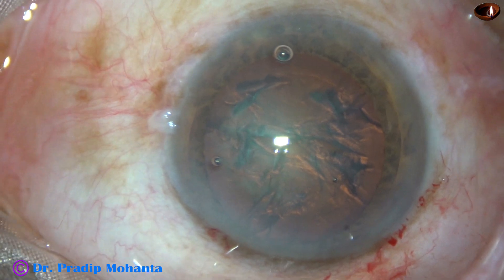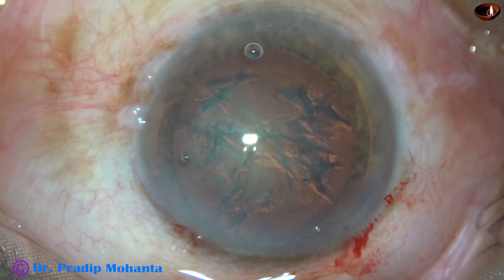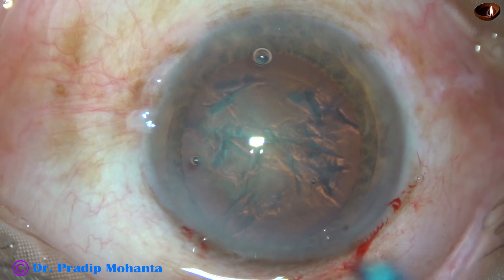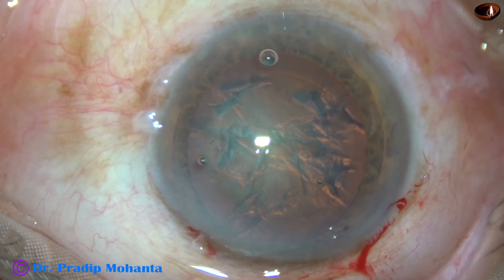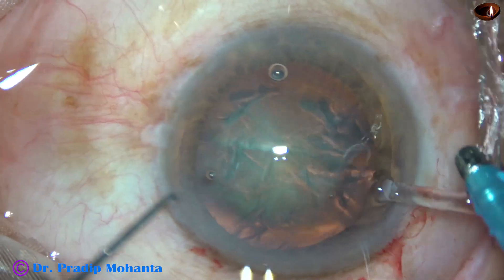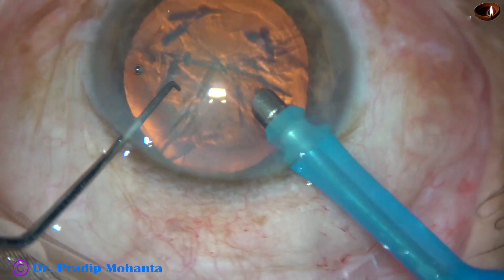The tip of the phaco needle is introduced. The machine is set at 450 mmHg vacuum and 45 flow. Ultrasonic energy is set at 60%, but the ultrasound will be controlled by foot switch. And most of the time the ultrasonic energy used will be 20–30%.